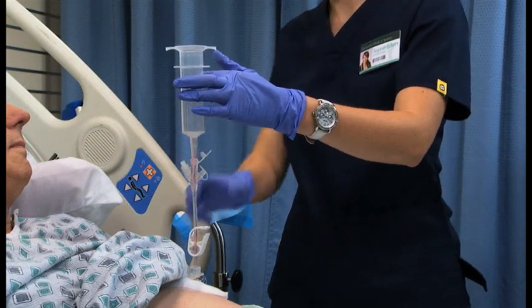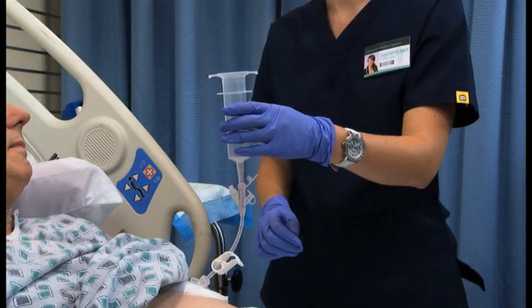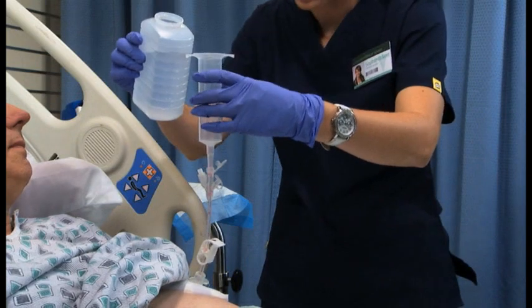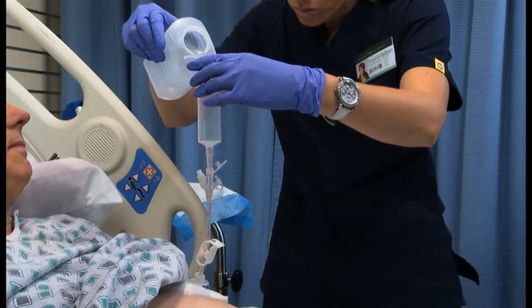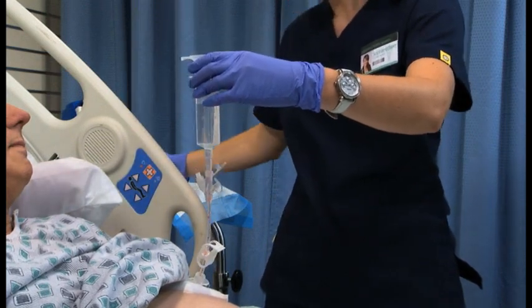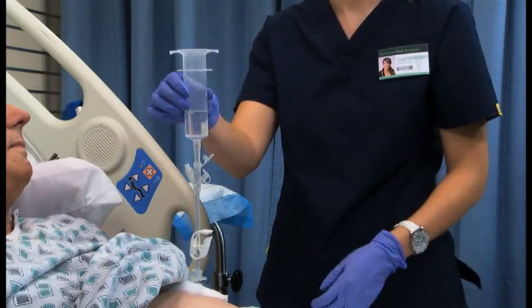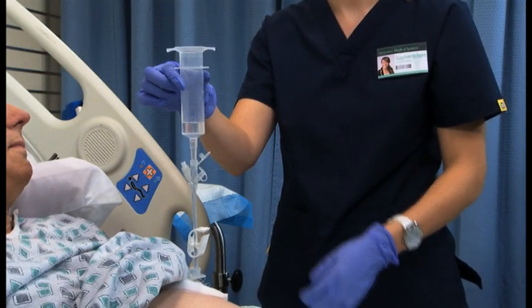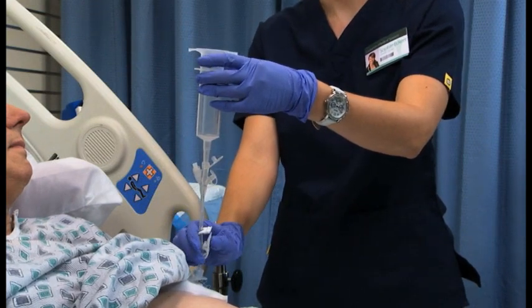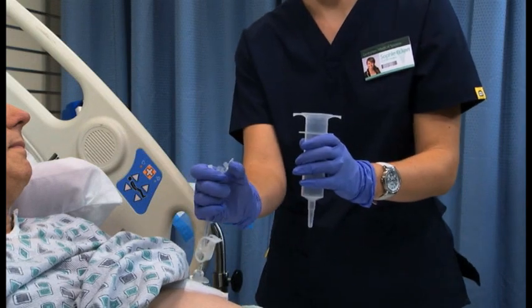Clamp the tube. Since you're finished with the medications, you should pour 30 to 60 milliliters of water into the tube to make sure the medications are completely removed from the tube. Unclamp and allow the water to flush the tube. Then I clamp the tube. And I remove the syringe and replace the end cap on the tube.